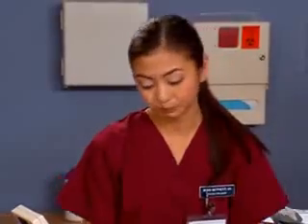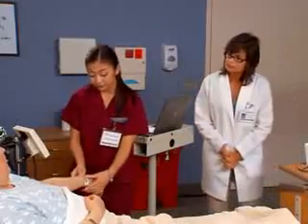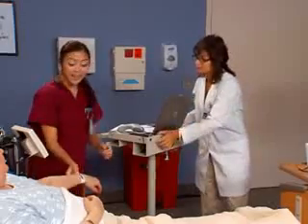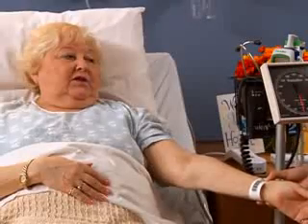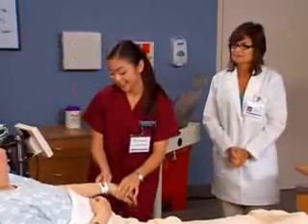Yes, of course. Can I have a look at your wristband? Sure. Thank you. And your full name? Irene Hodge. And your birthday? December 6th, 1934. Great, thanks. Can you hold a thermometer under your tongue? I would hope so. Anything to eat or drink in the last half hour? No. Gum? Smoking? Heavens, no.